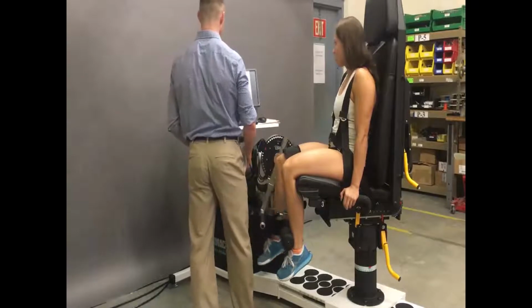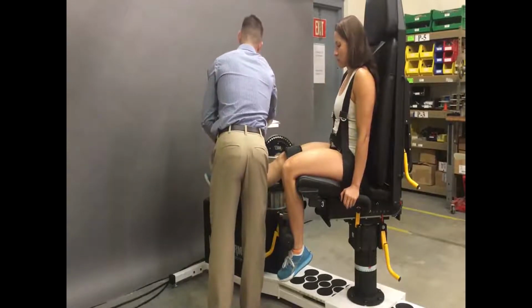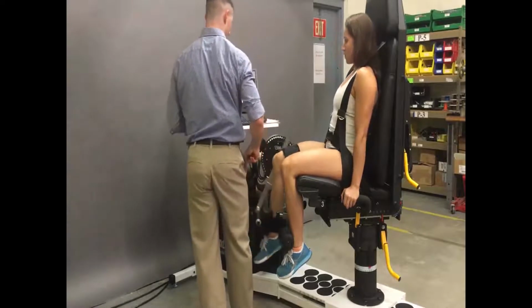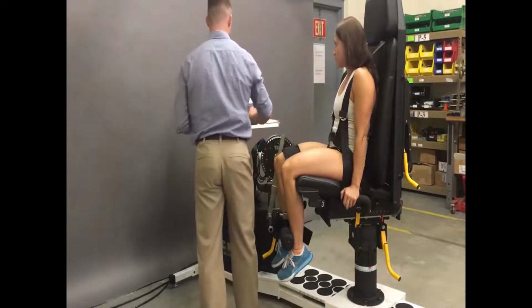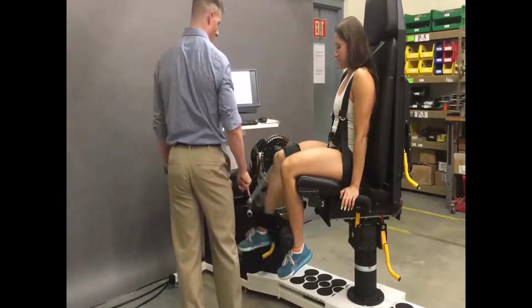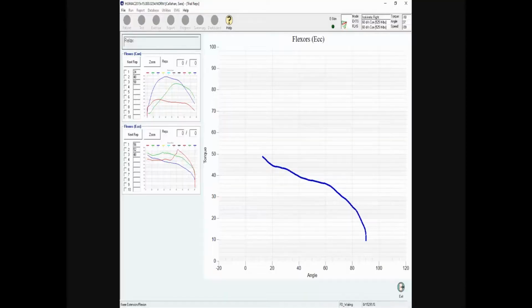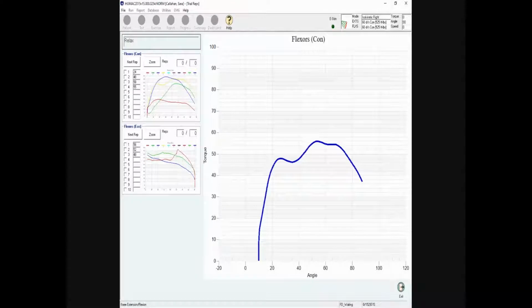Now you don't have to test the hamstring of every patient. I usually only test those of our ACL reconstruction patients. But for our typical anterior knee pain, medial knee pain, patellar tendinopathy, osteoarthritis, the patients that I really just suspect or I want to test that extensor mechanism, go ahead and just test the quad. That's where you get to use your clinical judgment.